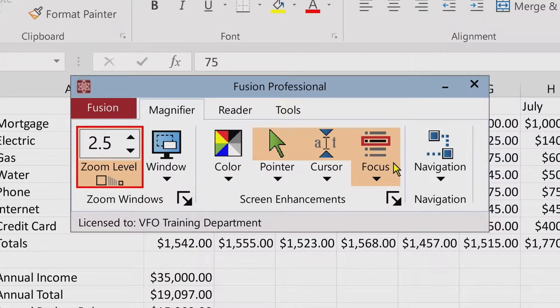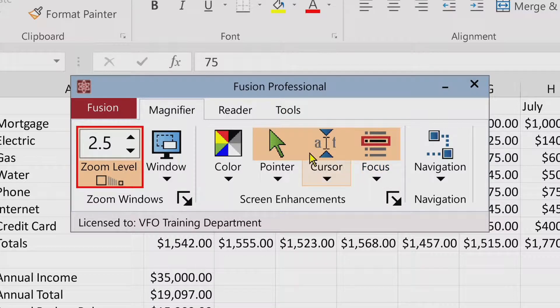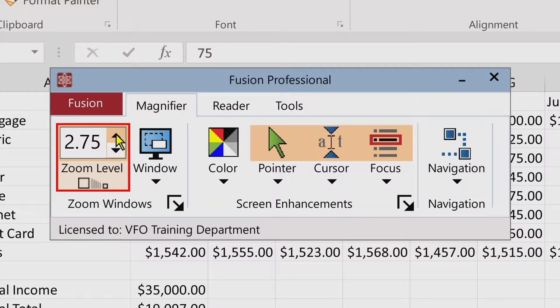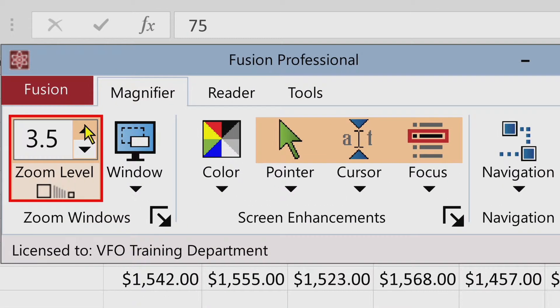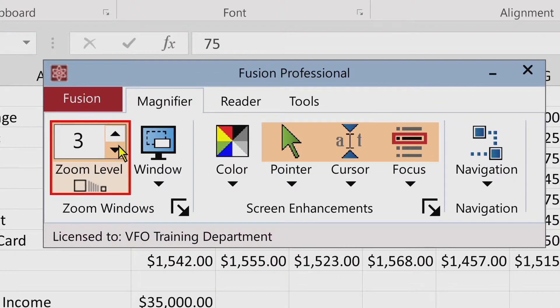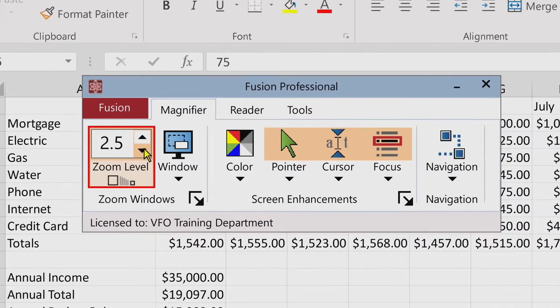How to increase and decrease the magnification in Fusion. Zooming in and out can be accomplished in several ways. One of the most intuitive ways is by clicking the up and down arrows in the zoom level spin box, which is in the Fusion Professional toolbar. I'll click the up arrow to increase zoom level — 3, 3.5 — and I'll click the down arrow to decrease zoom level — 2.75, 2.5.